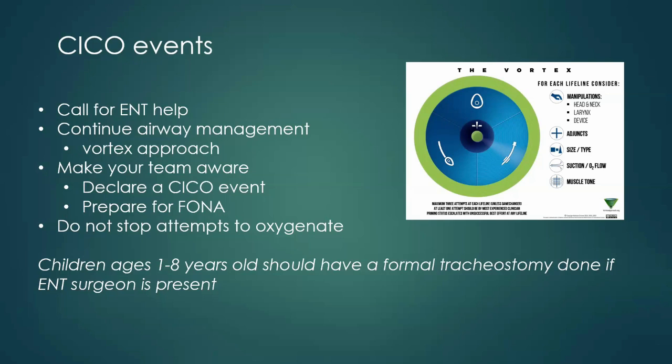So if you are in a situation like this and you cannot intubate, you cannot oxygenate, you've got your three strikes and you're out, or you've tried twice on intubations with the best attempts that you can to visualize, you're using a VL, you've done your bend at the head, you've done your ELM, everything. Do not delay this, because you will end up in a situation where the patient's going to arrest.